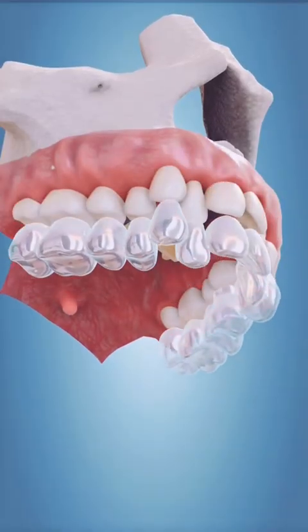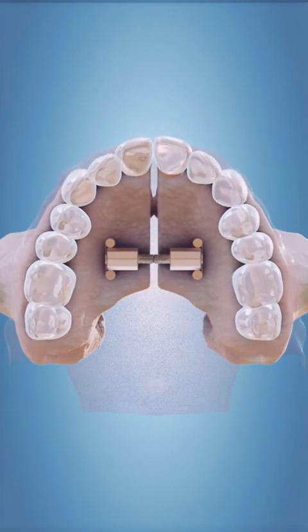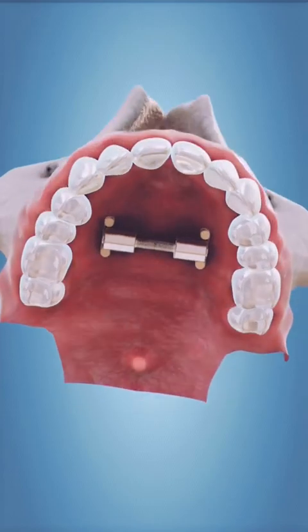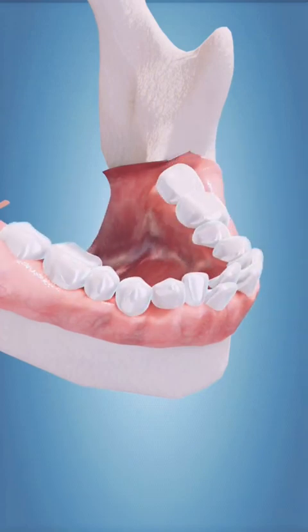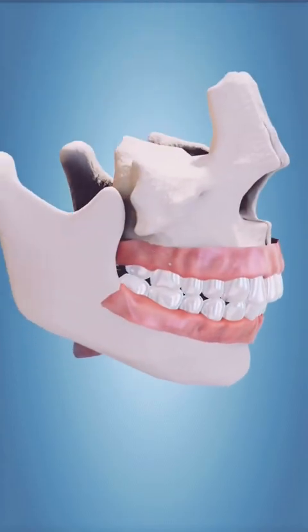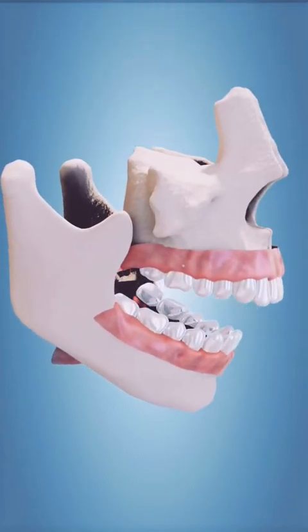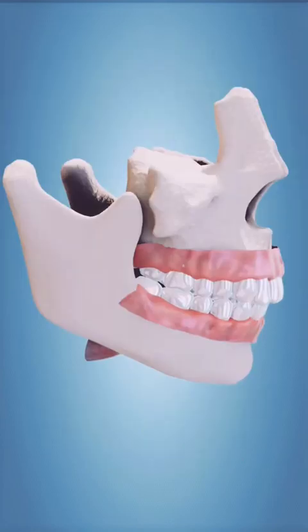One of the benefits of an unbanded MARPE — that is, an appliance that only connects to the palate — is we can actually place clear braces or Invisalign on the teeth, since the appliance is not getting in the way. It is very advantageous to move the teeth at the same time the MARPE is expanding the palate, so that our patient does not get large spaces between their teeth. Nobody wants large gaps, and once you create a lot of space, bringing those teeth back together becomes very difficult.